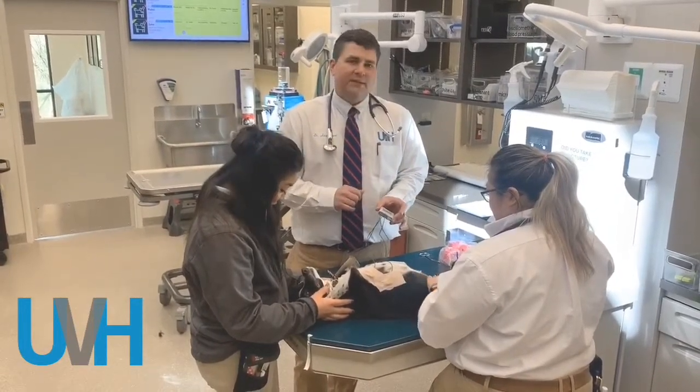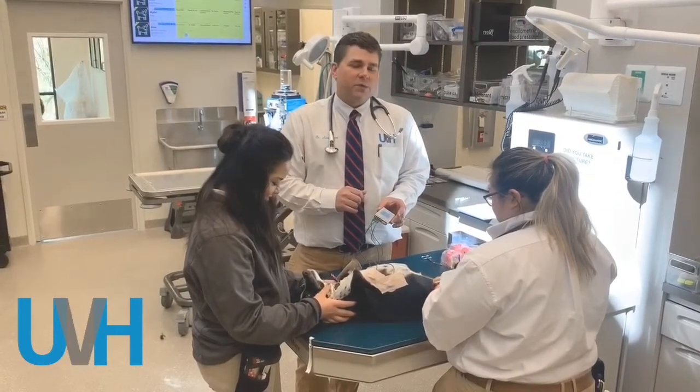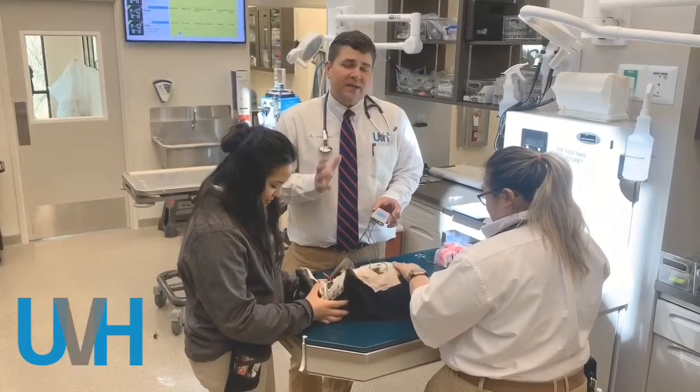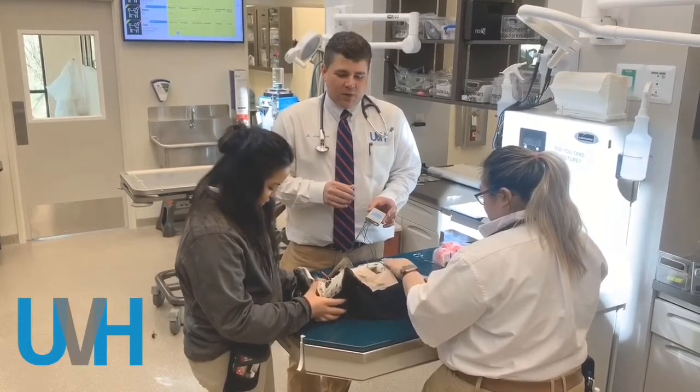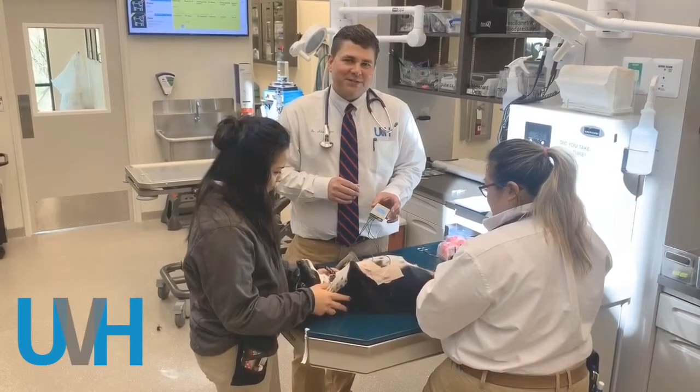The Holter monitor is like a little backpack that they wear — they actually go home with it and we monitor it for 24 hours. We're able to look at every beat their heart takes for 24 hours to determine if they need any medications. So we're putting that on right now — just a sneak peek at what we do behind the scenes at UVH.